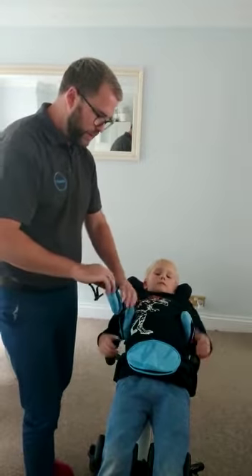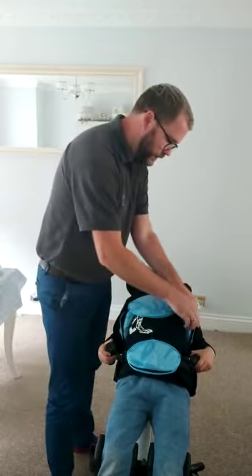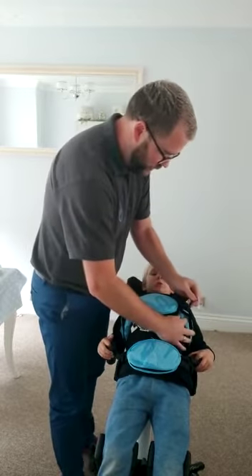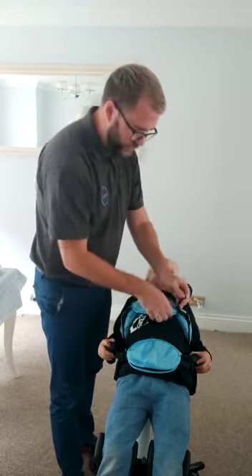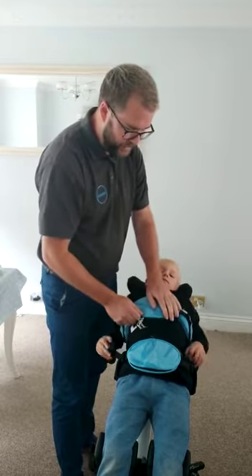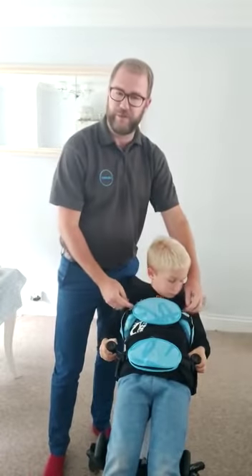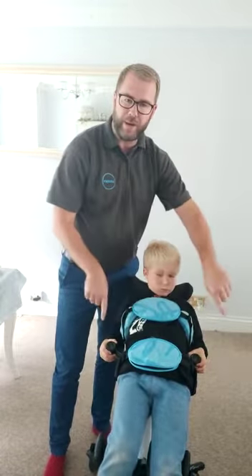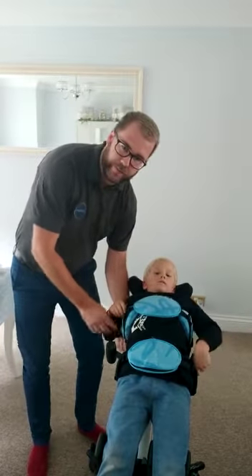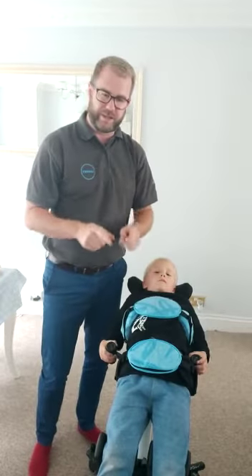Next would be your chest strap, which will go across like here and again you might need just to tighten that up a little bit. There we go — you can get rid of those excess straps by just lifting and tucking them underneath there as well. With these chest laterals, you might just move them in or out a little bit, and like the same with the pelvis there's a little thumb screw under here. Undo it and you can put that in and out — you just want about a finger's gap.